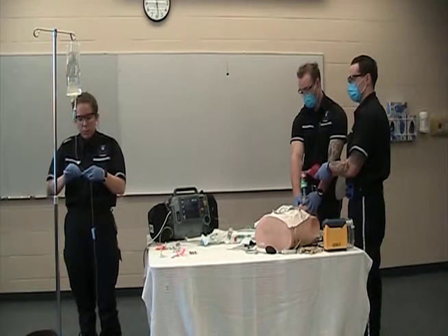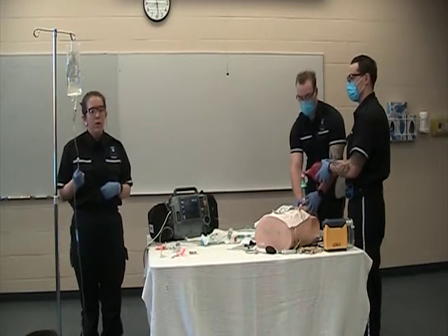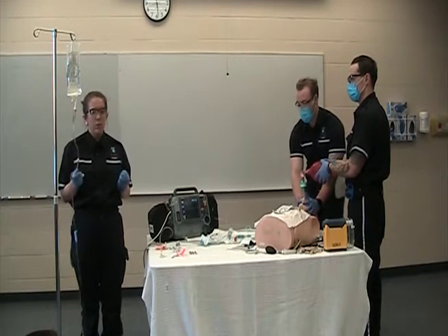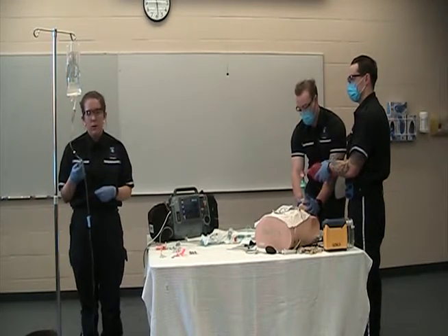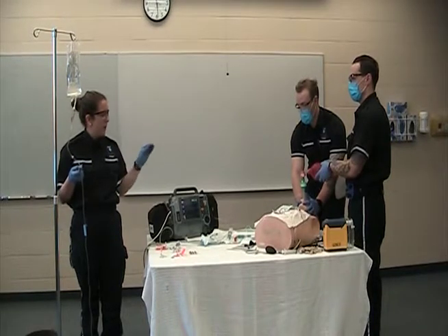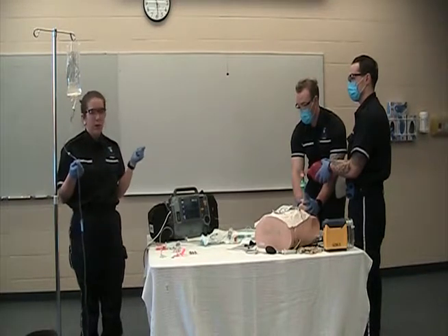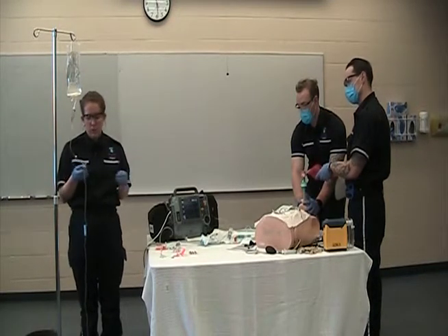With succinylcholine, we cut and expose all the clothing off of our patient, and we're looking for fasciculations. Fasciculations are small muscle spasms that occur because of the depolarizing nature of succinylcholine. So you're going to be looking at the feet to the head and looking for small muscle twitches. I'm going to have both of my partners, one looking at the head and one looking at the feet.